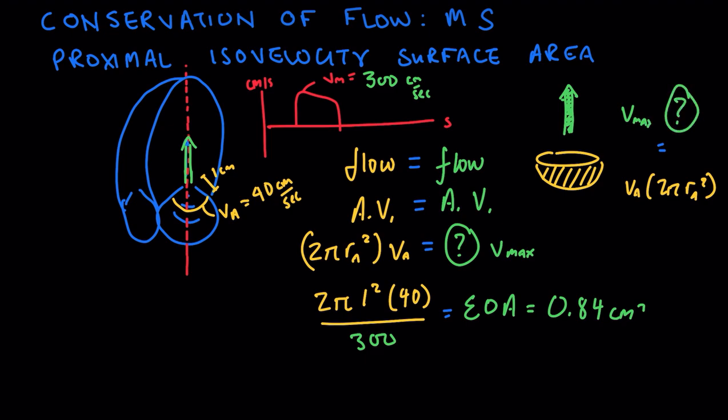One additional point, some nuance that you can add on top. I've drawn this as a pure hemisphere. Sometimes it's not quite a hemisphere. In other words, sometimes you may have more of a shape like this, where it's part of a hemisphere, as opposed to a pure hemisphere.